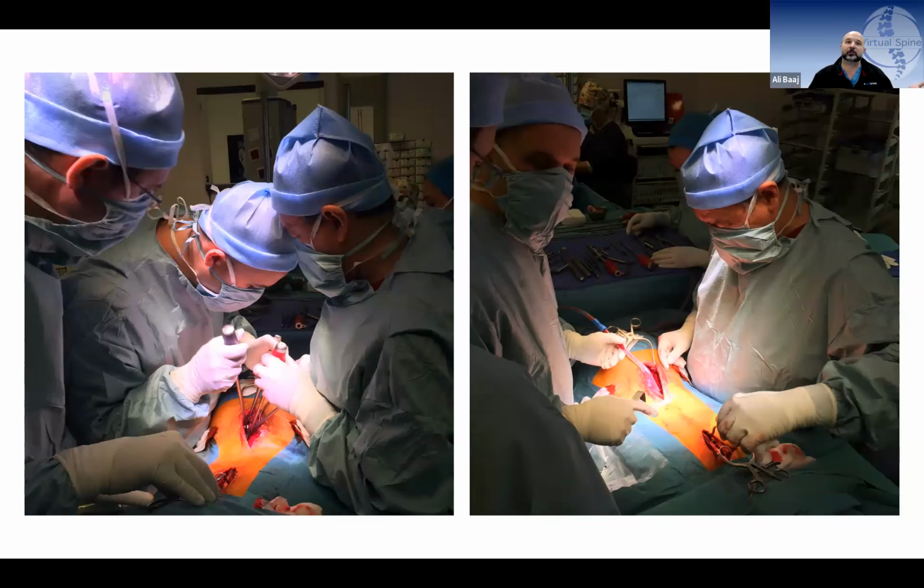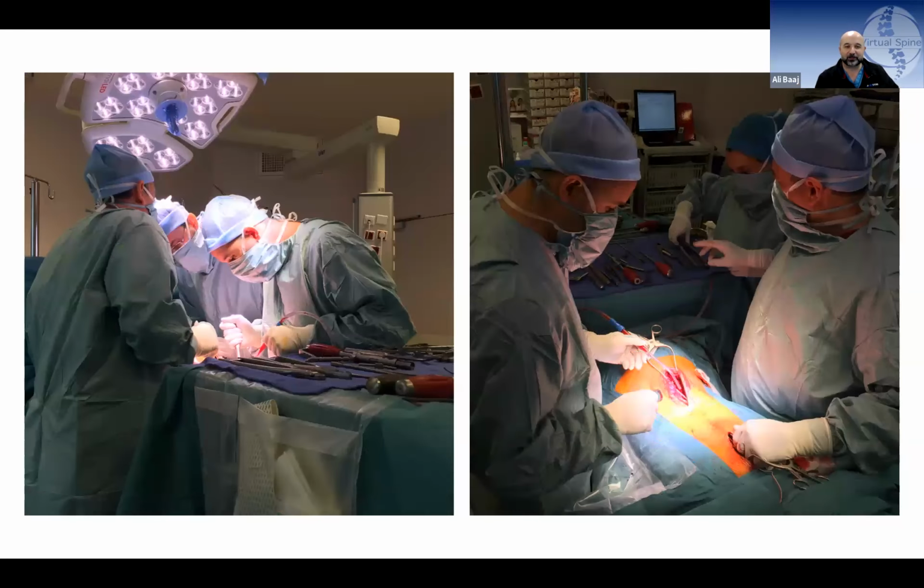I mean, I'm aware, as all of you orthopedic surgeons are, of the iliosacral screw, that's common in ortho trauma. But this was really neat because it combined the iliosacral screw with your traditional sacropelvic fixation. And I always wondered why, we'll talk about this offline, why this didn't pick up in the U.S., because it's such a nifty, clever, minimally invasive technique.